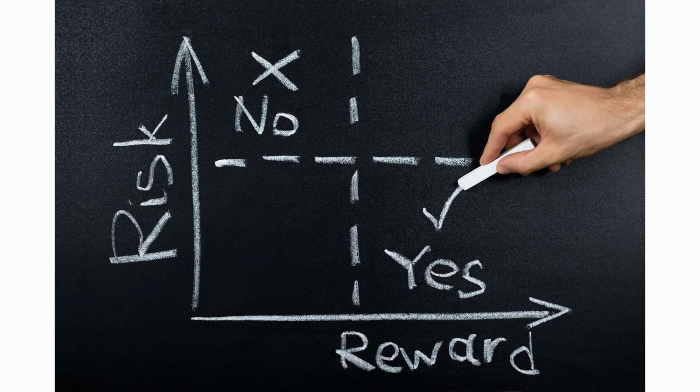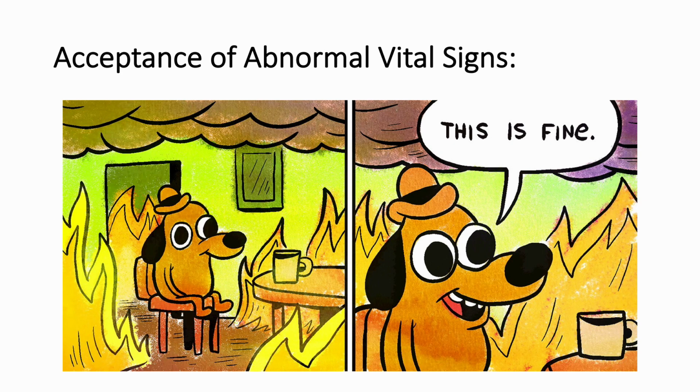Obviously, these situations are complicated, and as such, individualized discussion about the benefits and harms of sedation and paralysis are needed to ensure the best outcomes for our patients. That being said, it seems unlikely that excessive or unneeded sedation would be beneficial to this patient population. So what about the tolerance of abnormal vital signs? As we've just discussed, there are limitations and drawbacks to the strategies that are commonly used to improve oxygenation in VV-ECMO patients with abnormal SpO2 readings.